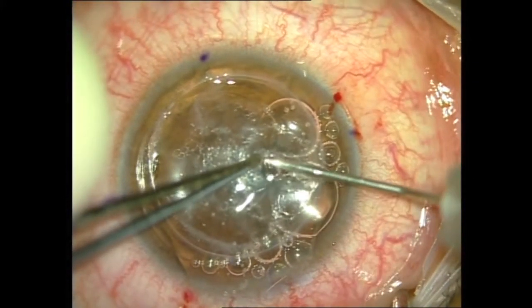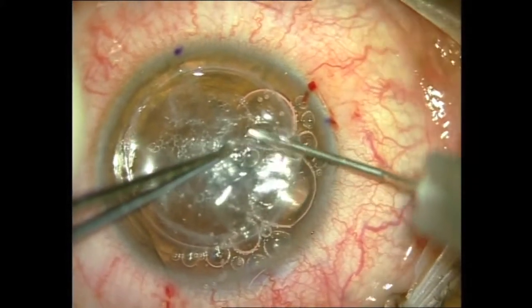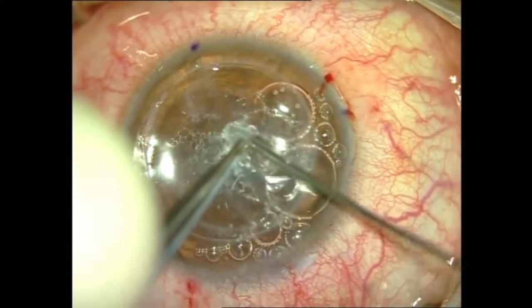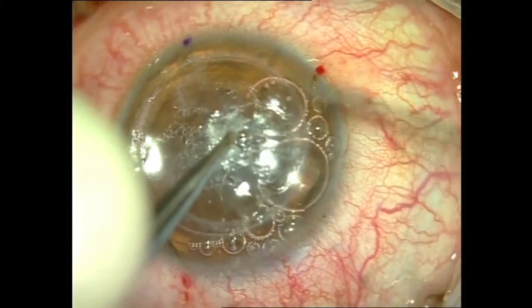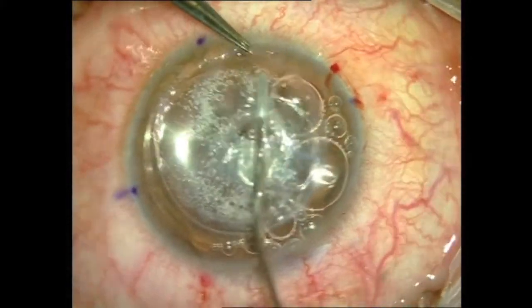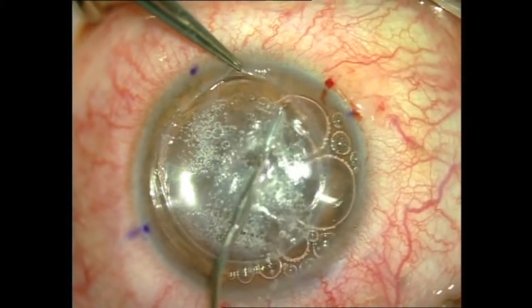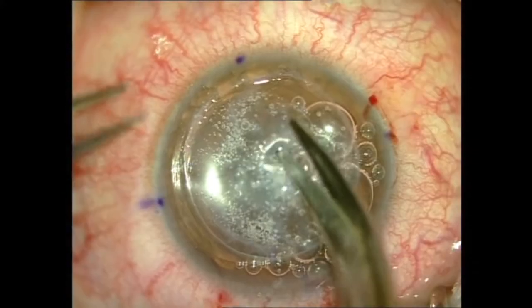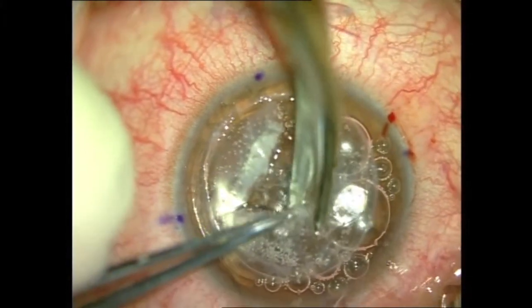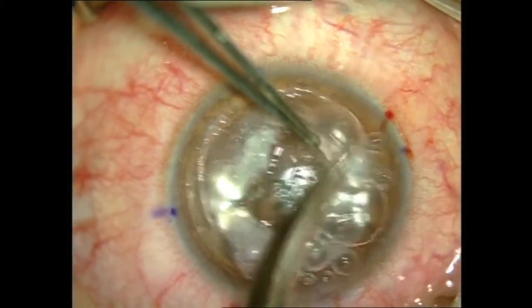Now I am doing another tunnel over one of the microbubbles and continuing the process of blunt dissection, introducing the viscoelastic cannula into the deeper layers and trying to separate more stromal layers. The process of dissection is continued over the whole surface of the cornea, and after completing it the stroma is again divided and each quadrant is cut till the trephination groove.